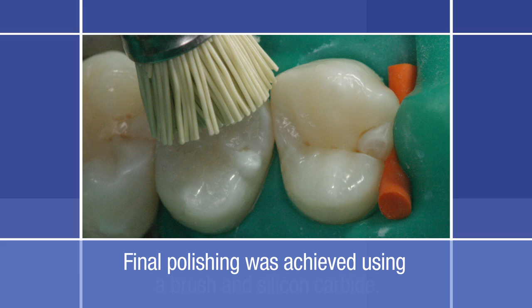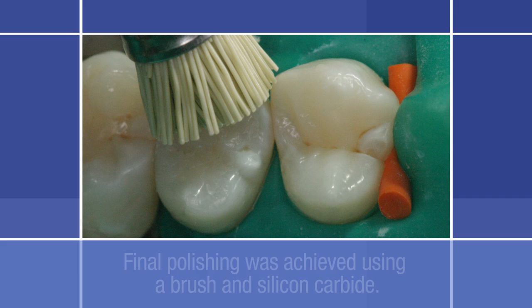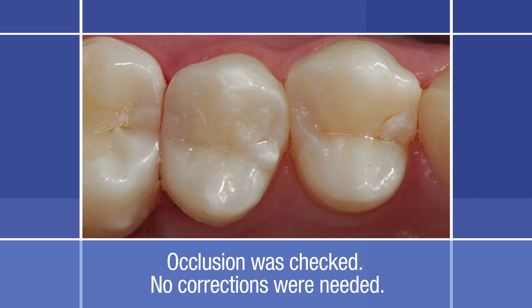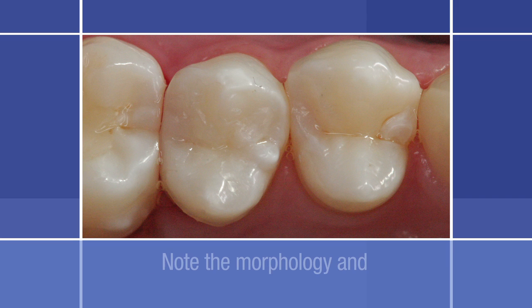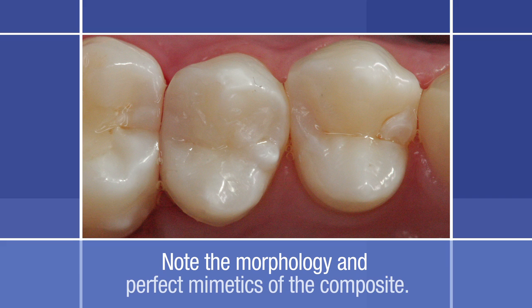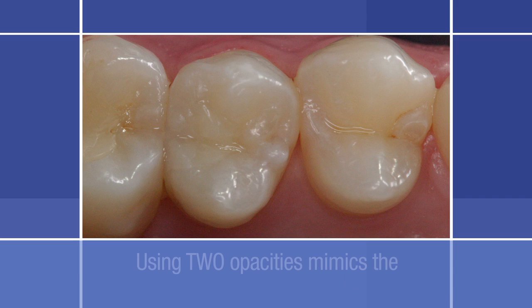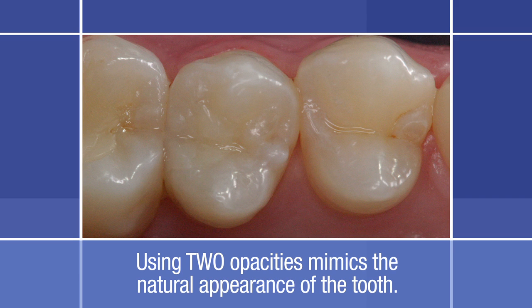The occlusal limit was then finished with white Arkansas stone pumice mounted on an angle handpiece. A silicone pumice completed the initial polish of the restoration. Final polishing was achieved using a brush and silicon carbide. Occlusion was checked after removing the rubber dam. In this case, no occlusal corrections were needed. The final view of the restoration lets us appreciate the morphology and perfect mimetics of the composite. A post-op checkup conducted eight days after the treatment revealed the restoration after complete tooth rehydration. Notice how using two opacities of Filtek Supreme Ultra Universal Restorative, dentin and enamel, to replace missing tooth structure resulted in a restoration that perfectly mimics the natural appearance of the tooth.